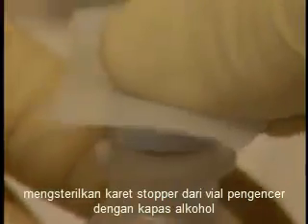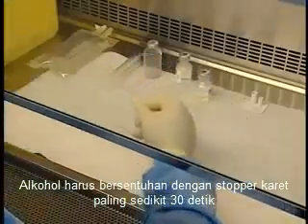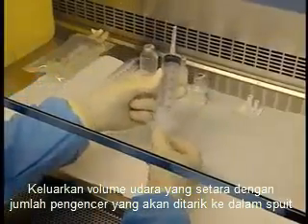Disinfect the rubber stopper of the vial of diluent with an alcohol swab. The alcohol must be in contact with the rubber stopper for at least 30 seconds. Draw in a volume of air equivalent to the amount of diluent that will be drawn into the syringe.